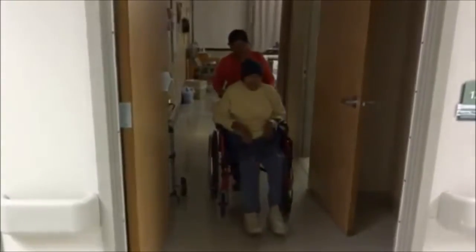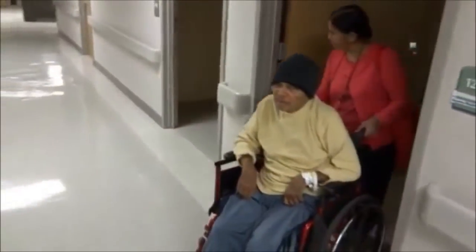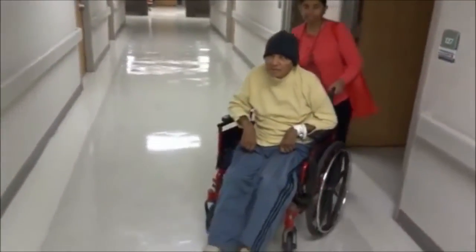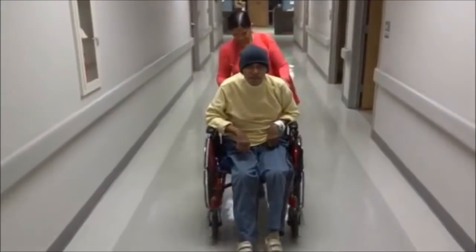These are wheelchairs that people with disabilities can operate by themselves without the need to rely on other parties to move them around. A voice-controlled wheelchair is basically a wheelchair that's given oral commands — front, right, left, back, stop — and responds accordingly.